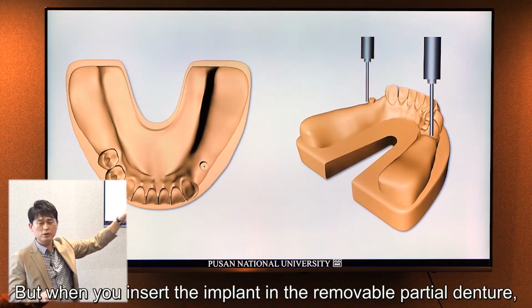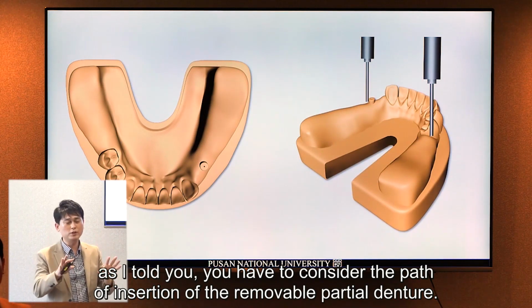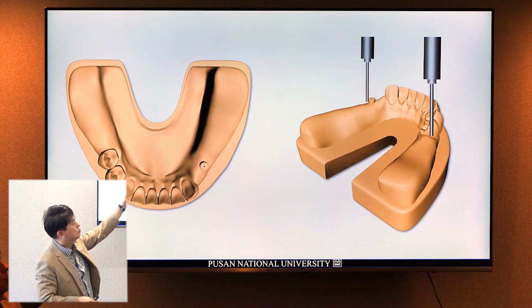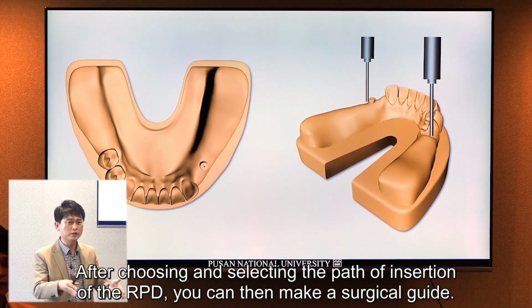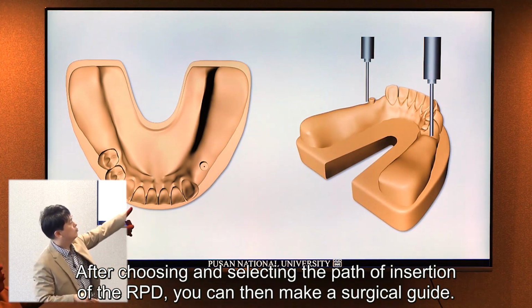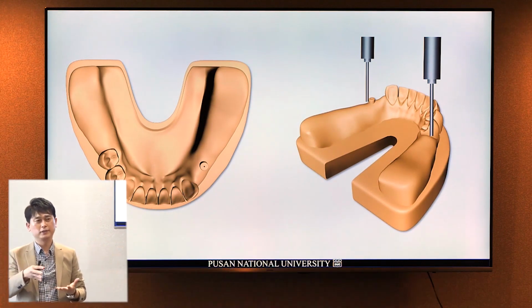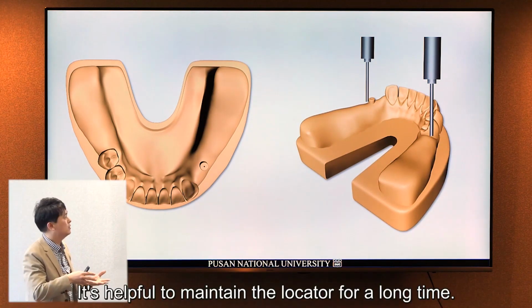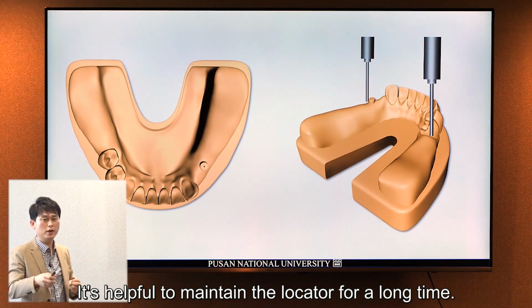But when you insert an implant in the removable partial denture, as I told you, you have to consider the path of insertion of the removable partial denture. So after selecting the path of insertion, you can make the surgical guide. So it's helpful to maintain the locator for a long time.